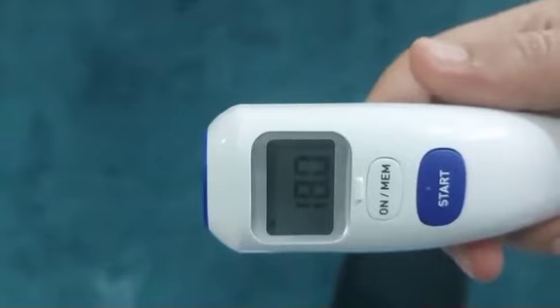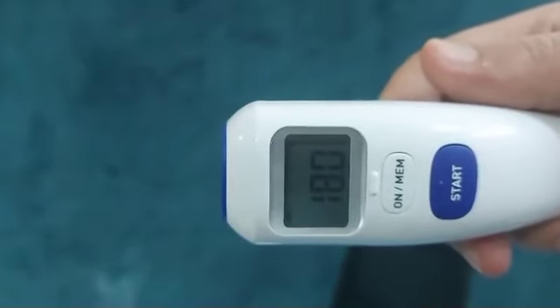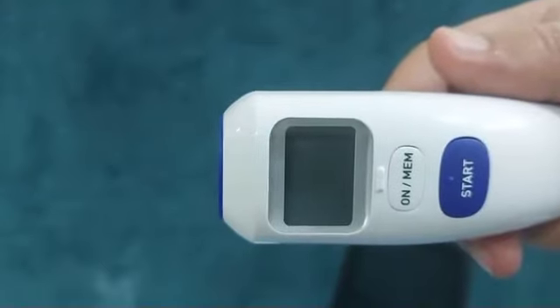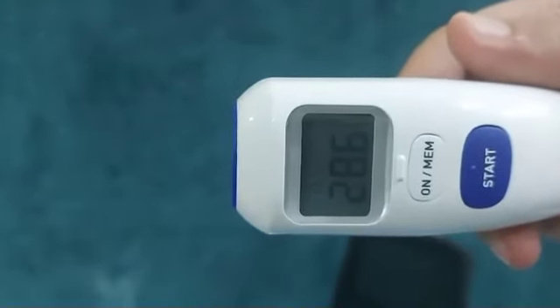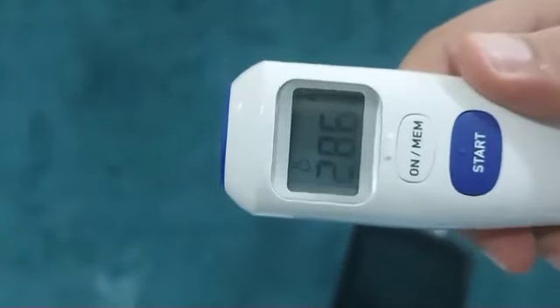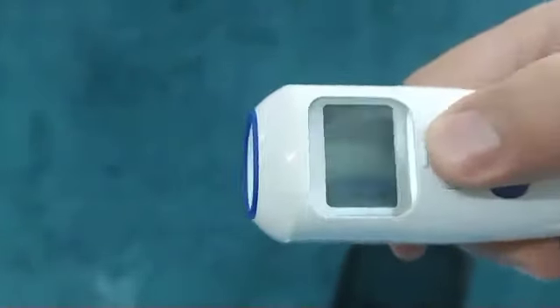Another fantastic feature of this Omron Gentle thermometer is the ability to check the temperature of a room. To do so, let the thermometer turn off on its own after a minute. After the thermometer is turned off, the room temperature will be displayed on the screen.